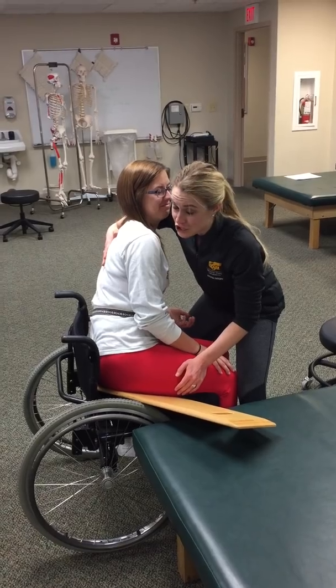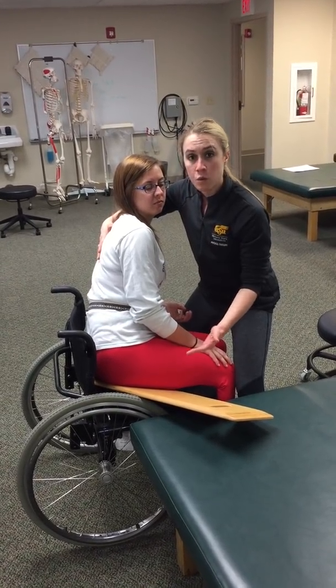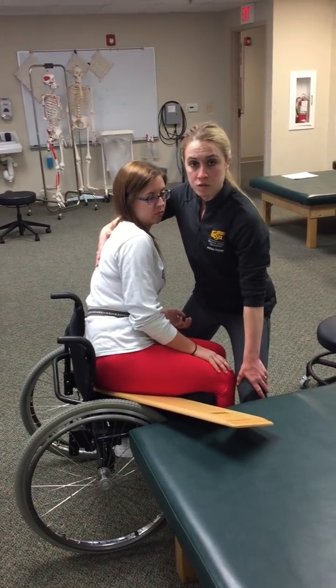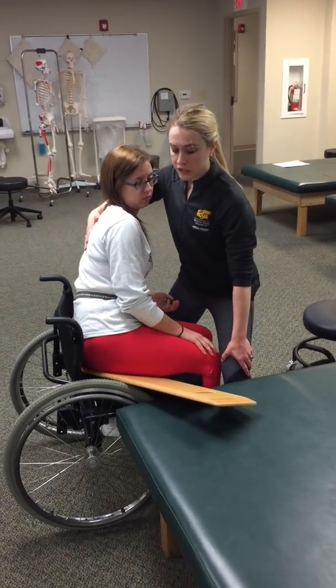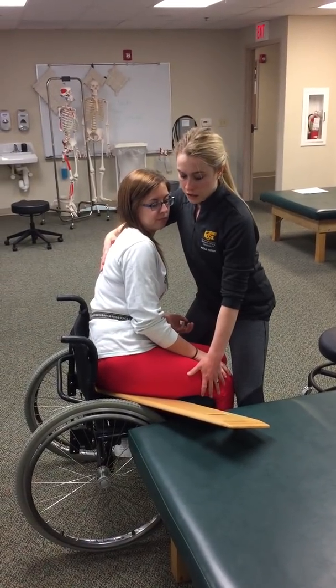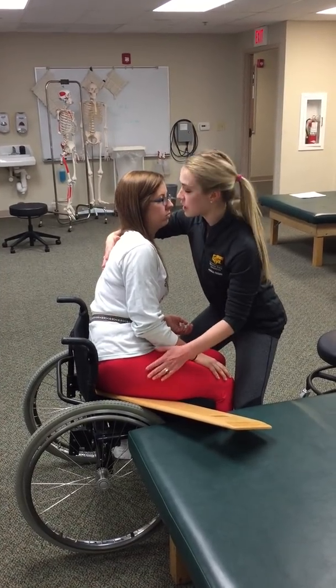This can certainly pinch. Also, this can become a problem if you are transferring a patient who has a wound or a sore. Very commonly, patients who are not able to move much on their own may have sacral wounds. There's potential ulcer development. You also may have people with poor skin quality. So you want to be very careful when you're positioning the board that you're not causing any skin irritation or breakdown.